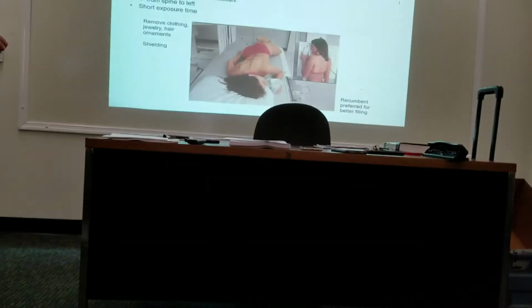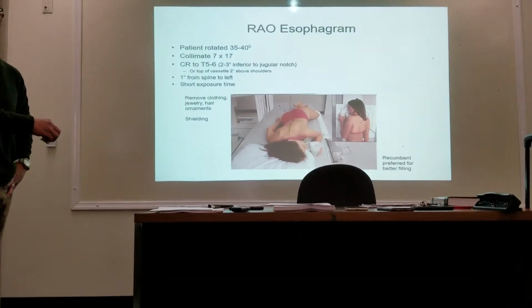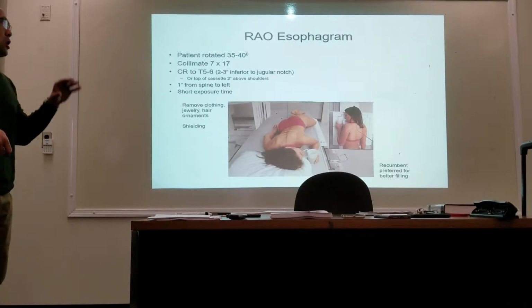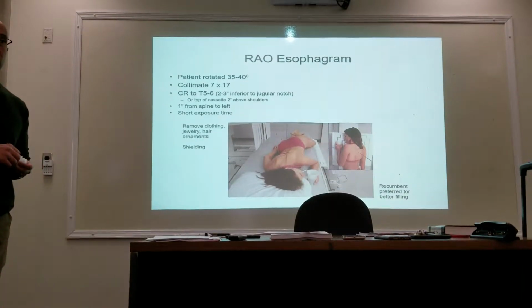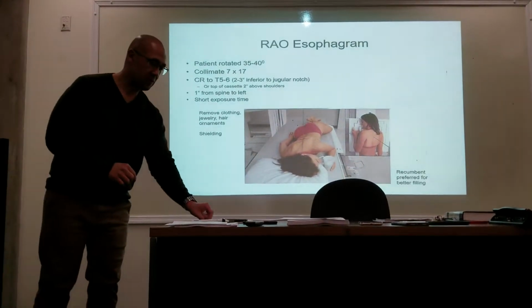Done traditionally by technologists is now being completed by the radiologist due to the advanced technology of imaging that we have nowadays. So you may not even be doing these in your department. Some of you will, okay, but not all of you. So what I'll be going over here are the overhead projections of the esophagram.